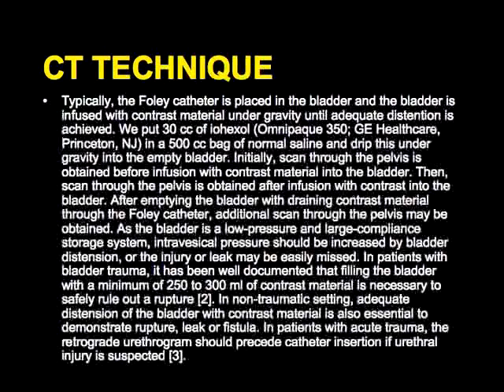Now, how do you do it? Very simple. Perfect solution is take a 500 cc bag of normal saline, add 30 cc's of Omnipaque 350, shake it a couple times, mix it up nicely, and then hook it up and let it drain in through gravity. That works very nicely, regardless of the application.